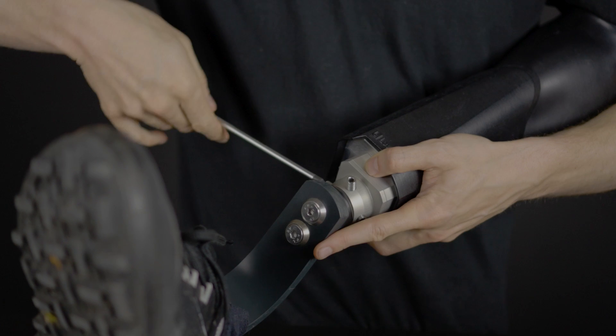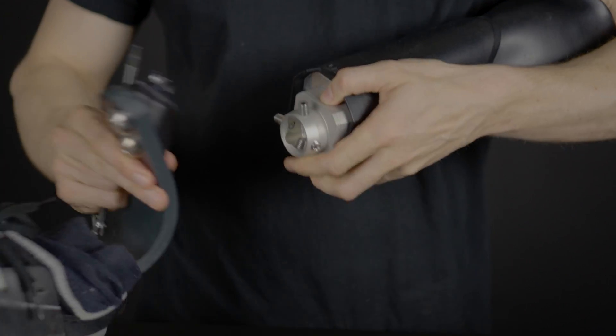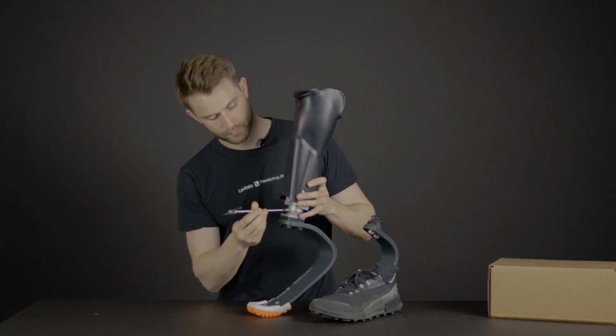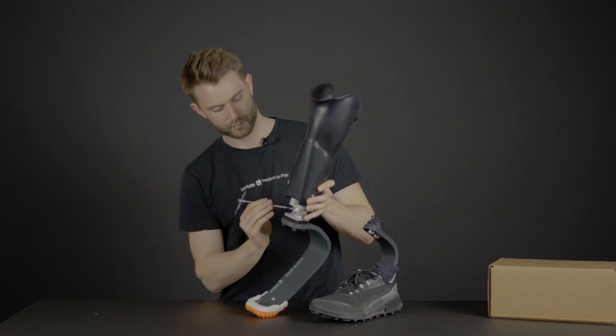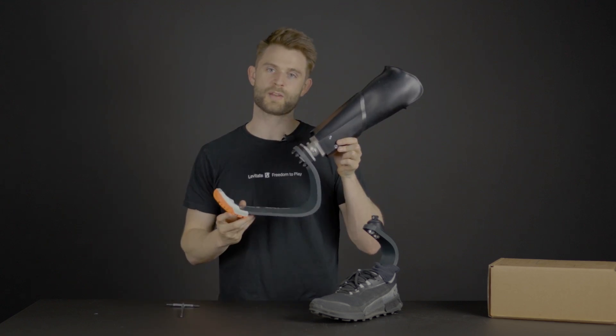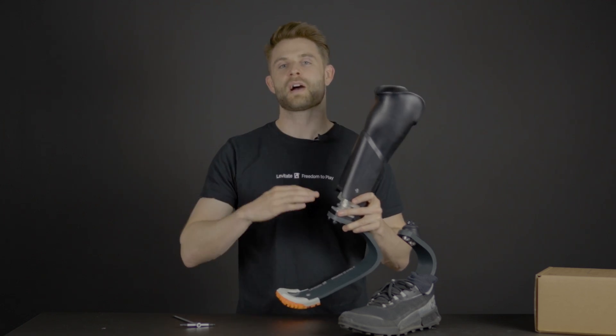It's pretty simple to swap from your everyday setup to your running setup. The only thing that you need to do is to use the Allen key that is supplied in the box. And now you're ready to run. So it's pretty simple to get back to your active life. In the box, there's a full description of how you install it to the correct height, how you get the right angles, and how you use the tools that are in the box.